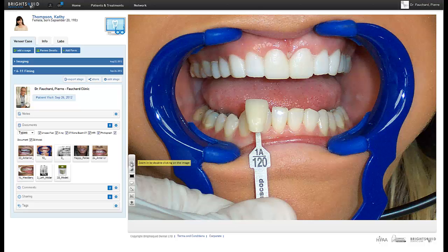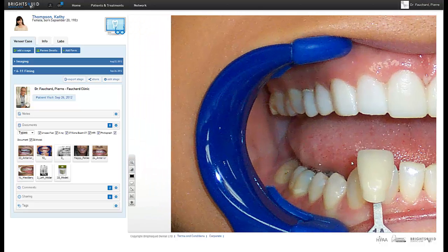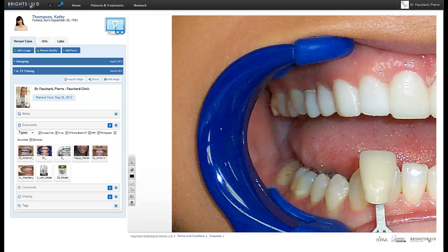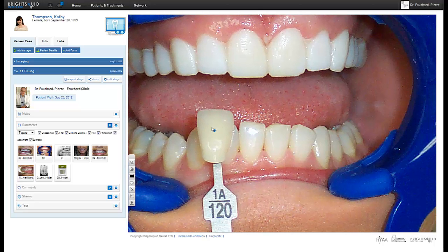The magnifying glass. Select this tool with a single click, then double-click anywhere on the displayed image to zoom in for a detailed view. Then you can click and drag the image to reposition it inside of the viewer.